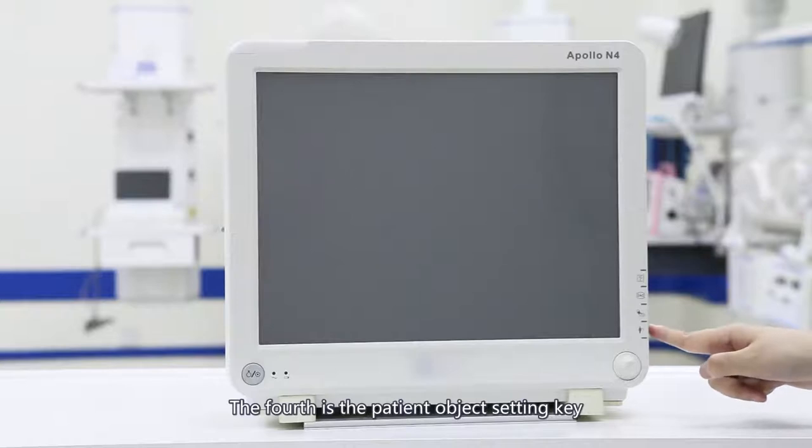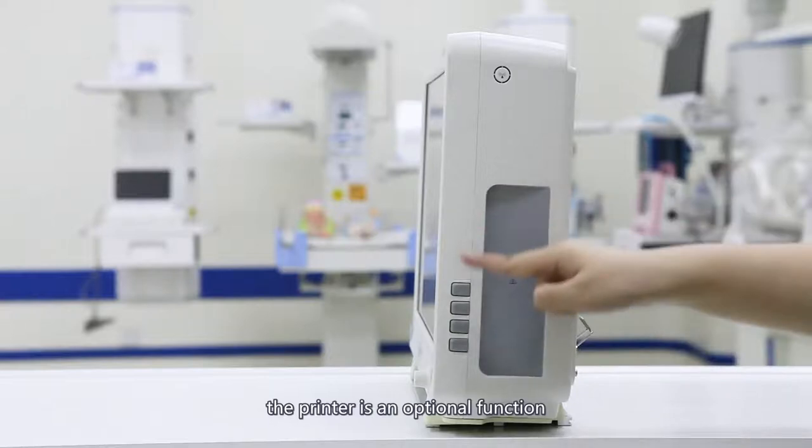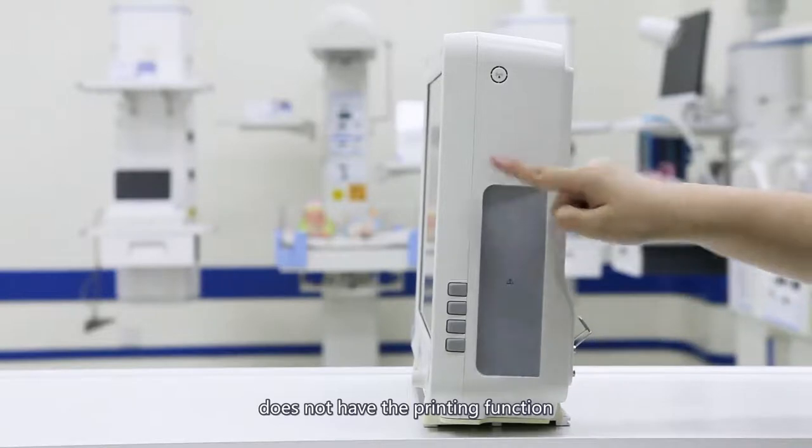The fourth is the patient object setting key. You can set the patient's basic information in this interface. The right side is the printer slot. The printer is an optional function; the standard configuration does not have the printing function.